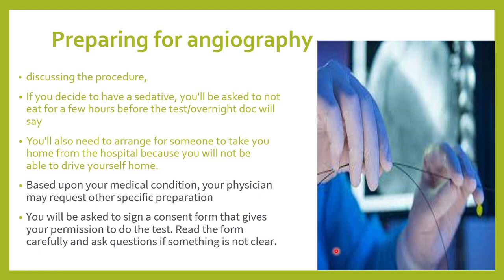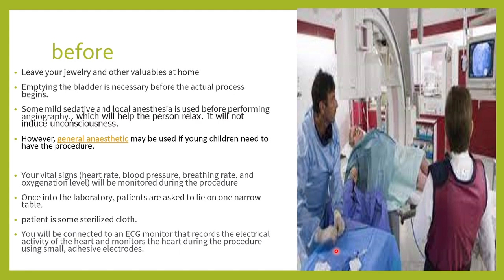So you need some standby person with you, and based upon your medical condition, your doctor will give you specific preparation. There will be a consent form, and you need to sign that consent form. You can read it, go through it, ask your queries, and then sign the consent form. Whatever jewelry or valuables you are wearing, you should keep at home. You should not bring them to the theater, and you should empty your bladder before the actual process begins.